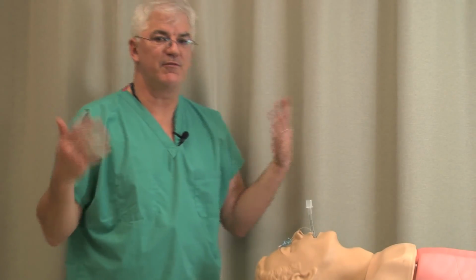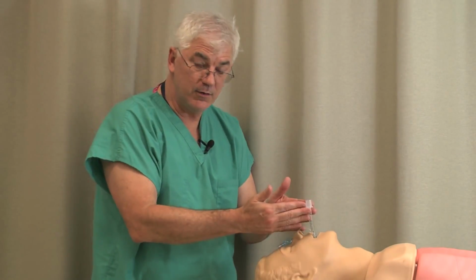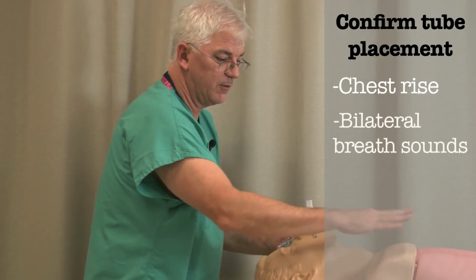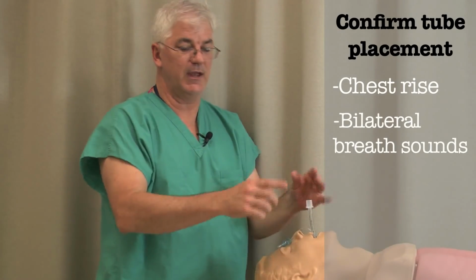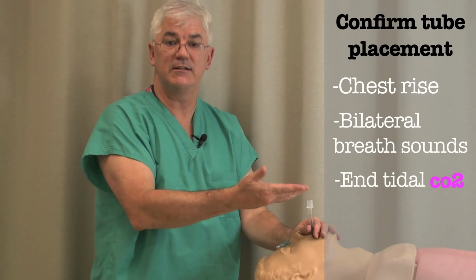Now, this is being prepared for MICU fellows, so you know this stuff, but I'll throw out a few things in case, say, someone at a more beginning level is starting out. How are you going to know you're in the right place? You're going to see the chest rise. You're going to hear bilateral breath sounds. You're going to hook up an end-tidal CO2 monitor and make sure that you see end-tidal CO2.